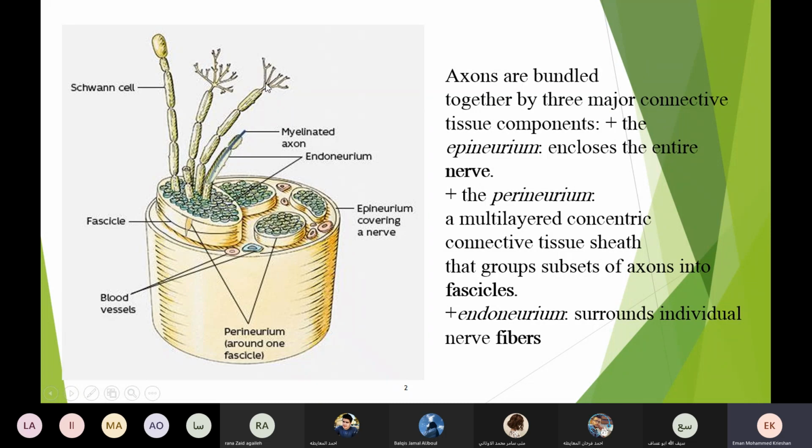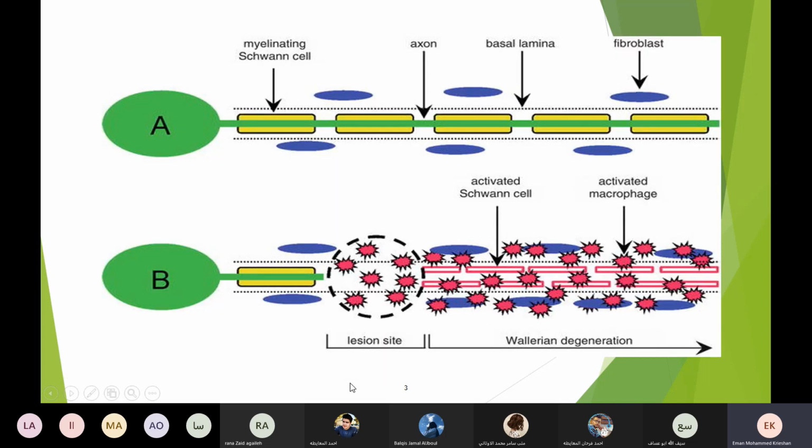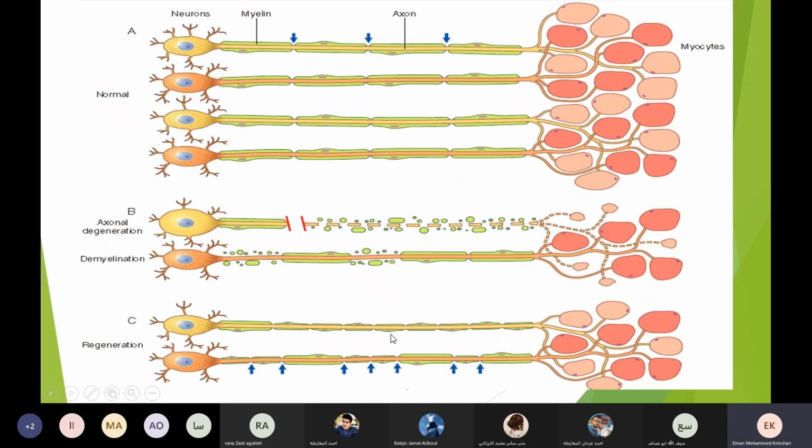These are the myelinated axon of Schwann cells and the axons. Okay, now, so these are the axon, the green rod here, and the Schwann cells that form the myelin sheath. So in Wallerian degeneration, as you remember, we said if there is degeneration of the axon, it is followed by degeneration of the myelin, but degeneration of the myelin will not degenerate the axon. So this is Wallerian degeneration. It's clear here. These are the axon, the myelin sheath.